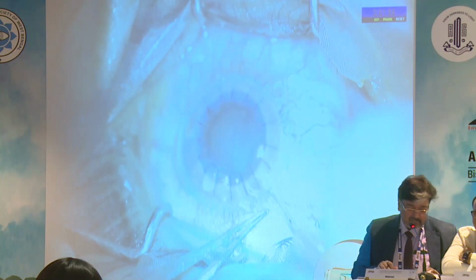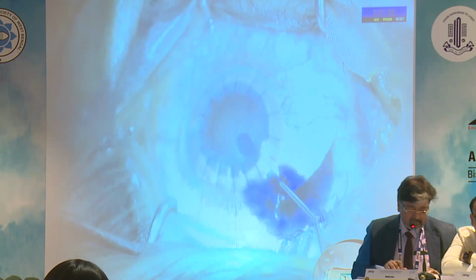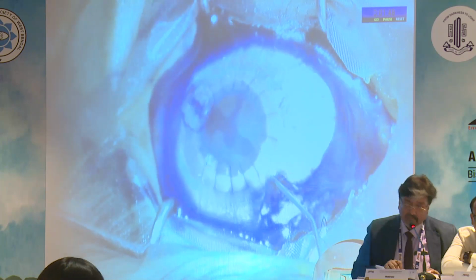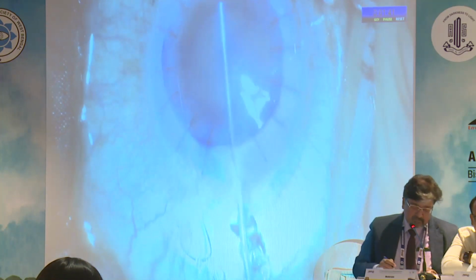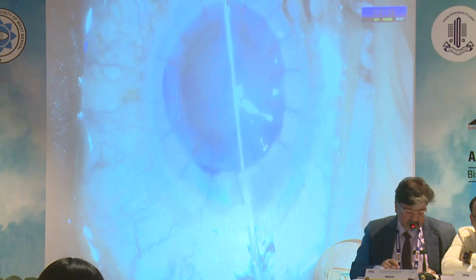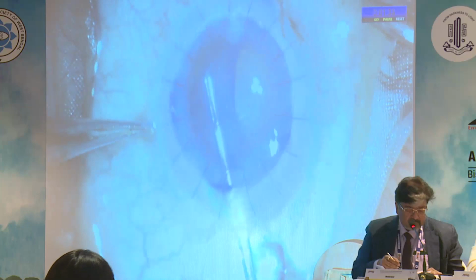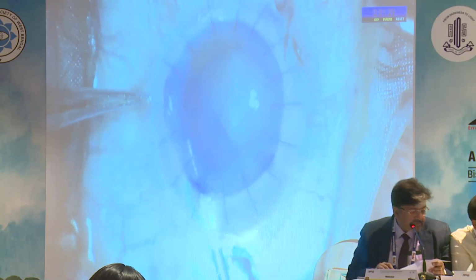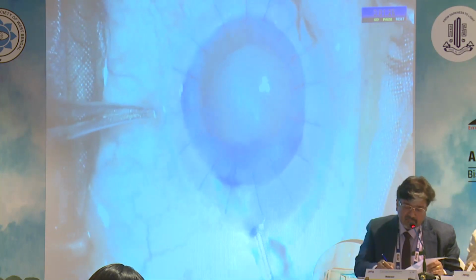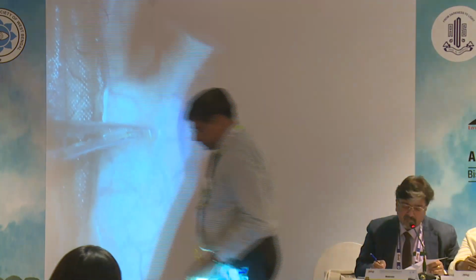A posterior limbal entry was made to avoid entry into the interface, and trypan blue dye was injected to stain the retained host Descemet membrane. OVD was injected through the graft host junction to form the interface space and push down the retained host Descemet membrane. Descemetorhexis was performed using an ILM peeling forceps from beyond the graft host junction in a circumferential manner to remove the retained host Descemet membrane without damaging the graft Descemet membrane.